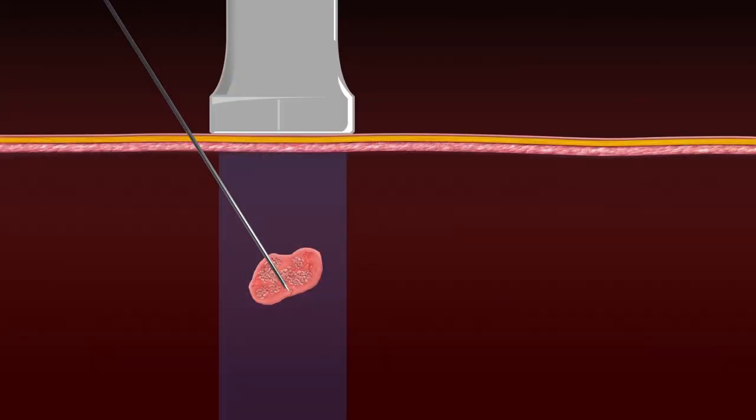The advantage of using the parallel approach is that the needle path is visible throughout positioning and sampling, therefore providing excellent control and information of the needle tip position at all times.